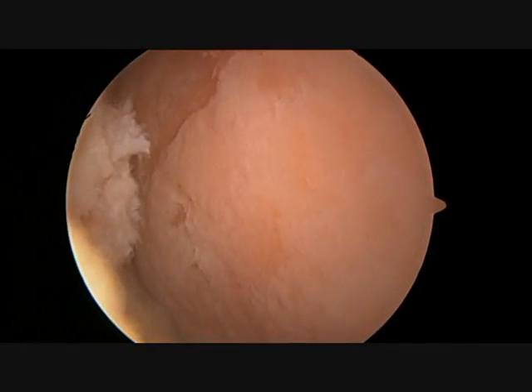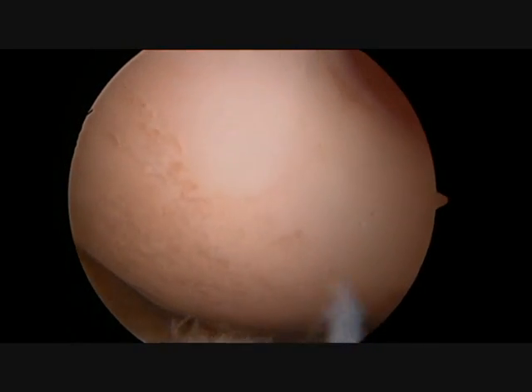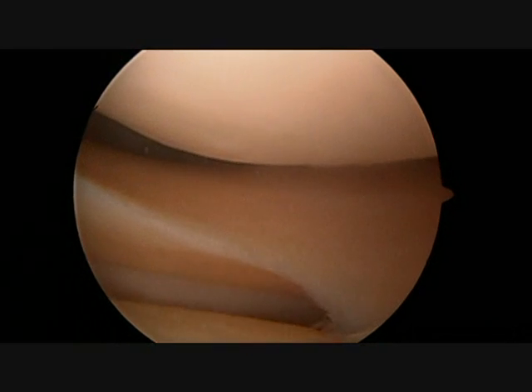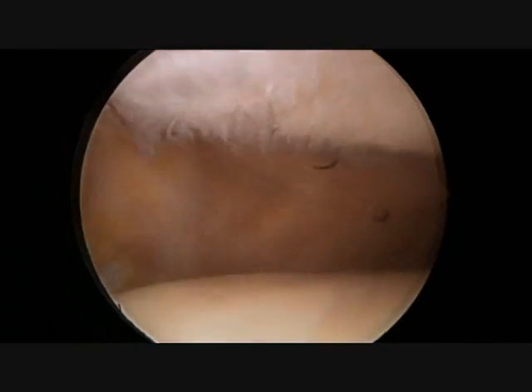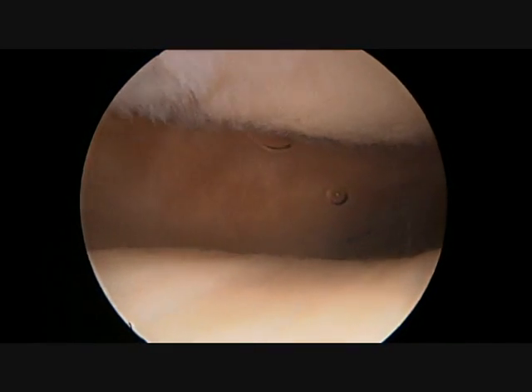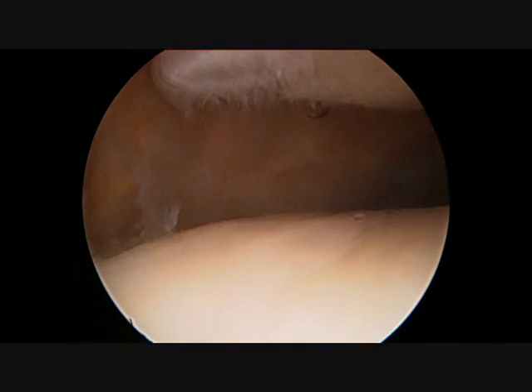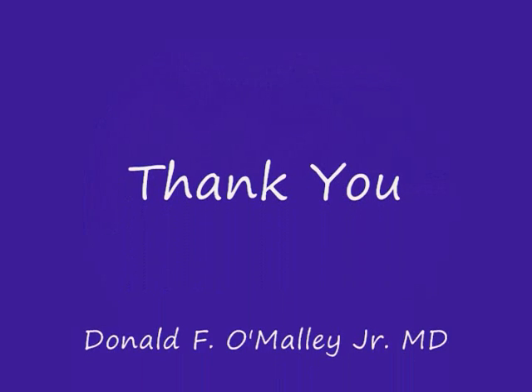I will take one final look at the entire knee to make sure that I didn't miss anything. On this view the different appearance of the knee cartilage is obvious. It is no wonder that arthritis causes so much stiffness and pain since the joint surface is so rough compared to normal. The knee has been cleaned up and the patient can start on the road to recovery, but this is still not a healthy knee and will require much more work in the coming years.